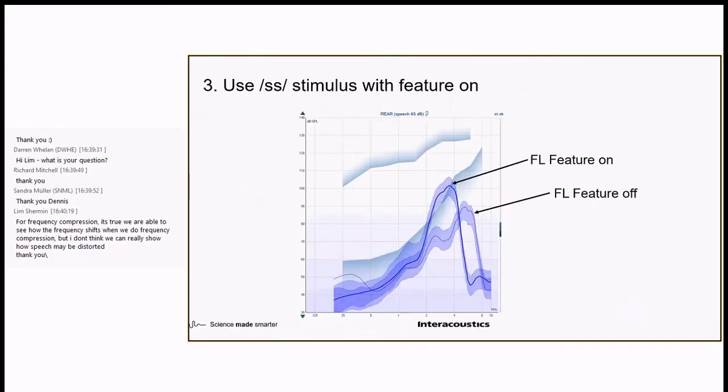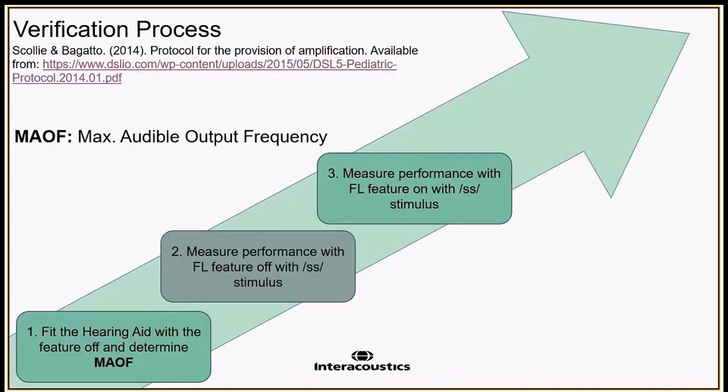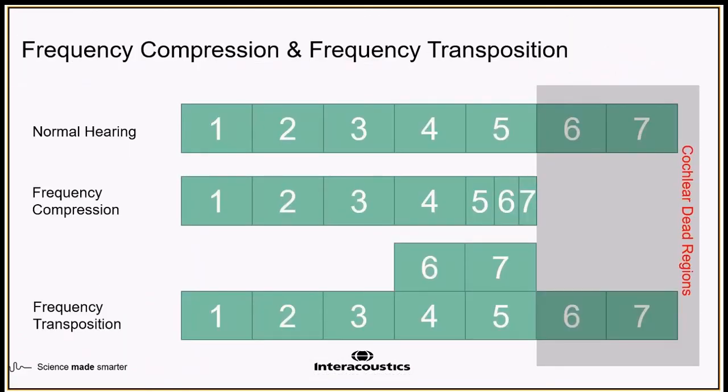So one key word that's been used in this question that I think is very useful to discuss here is distortion. Remember, we are changing what is heard by the hearing aid user compared to the incoming signal. And by placing these sounds in this area, we are providing distortion to them. So yes, we add this here, but we're also affecting 5.